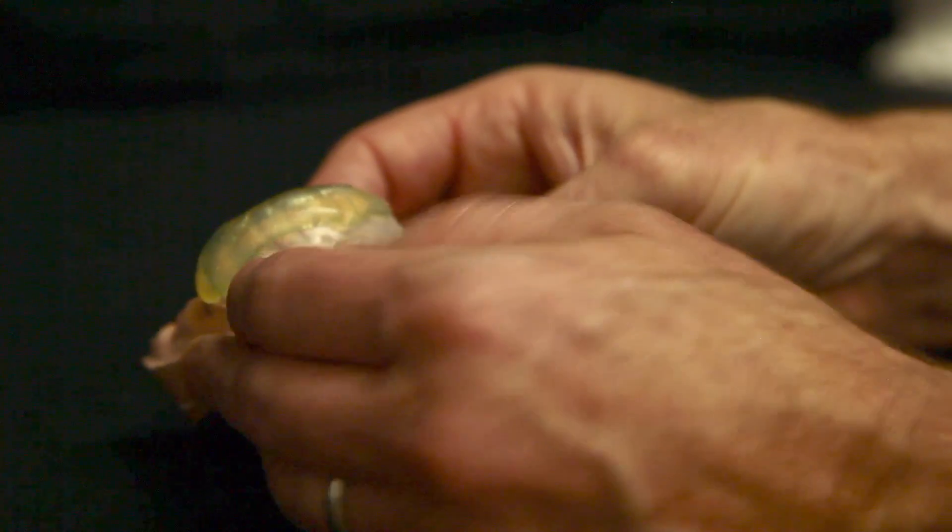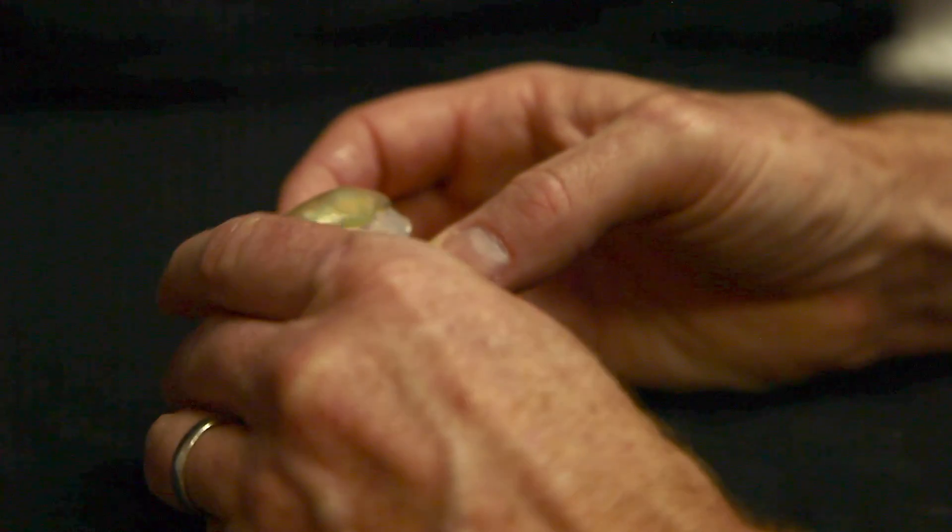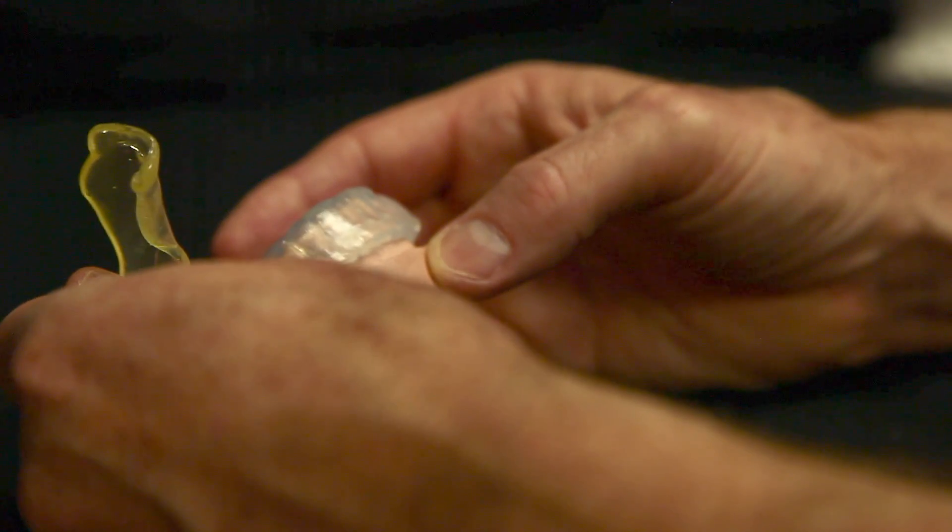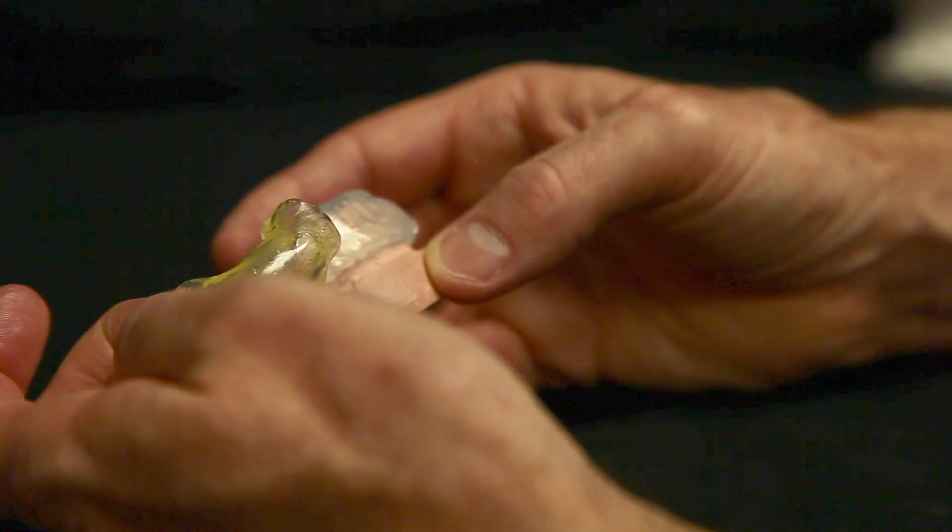So now we've set our material. And you can just lift it off. And you can put this in your Triad unit now and finish curing it.